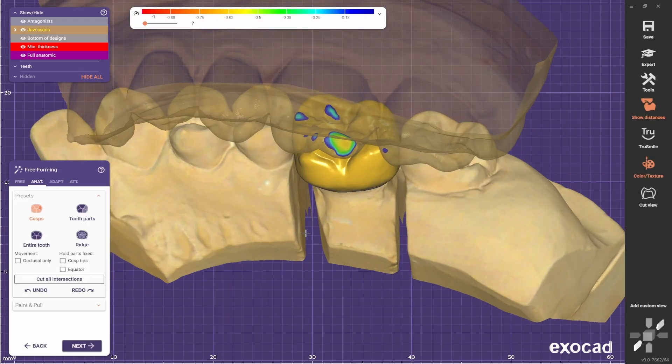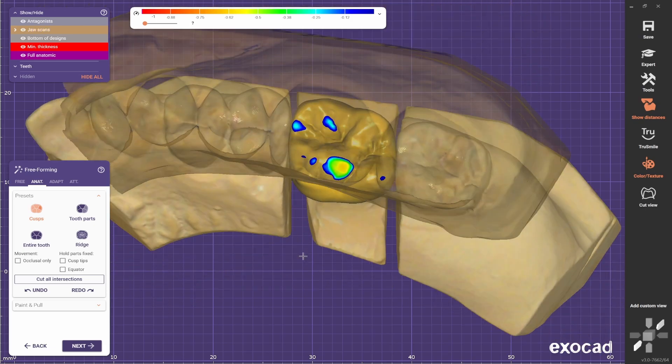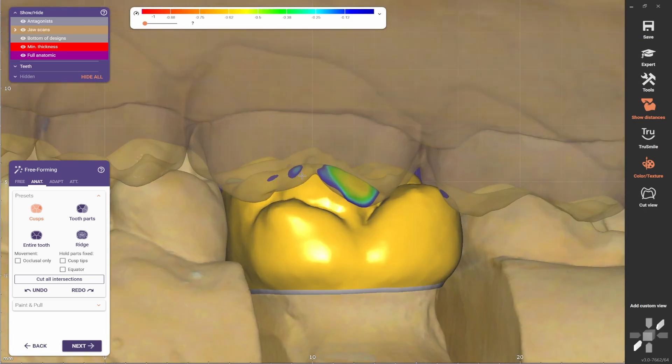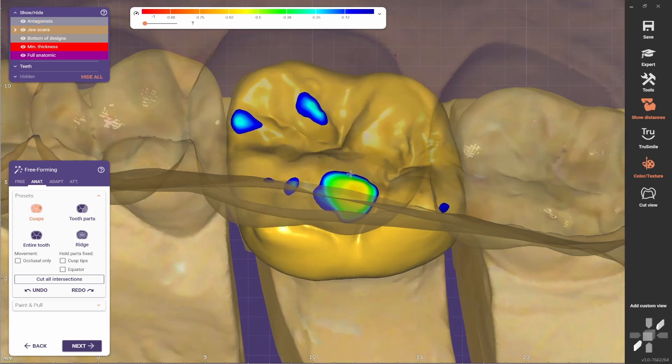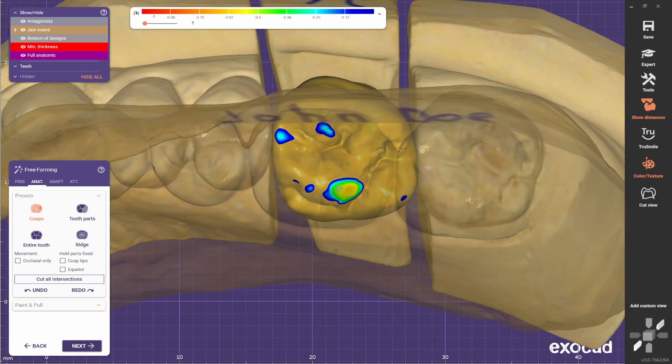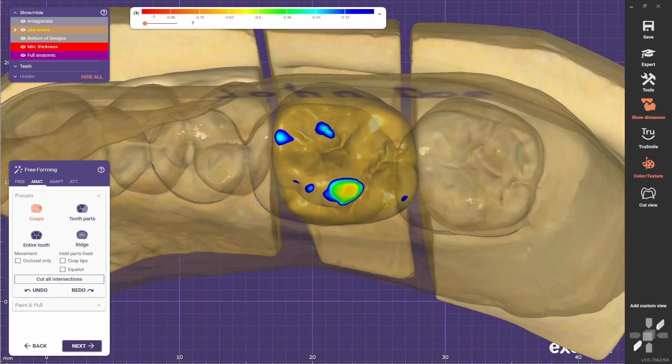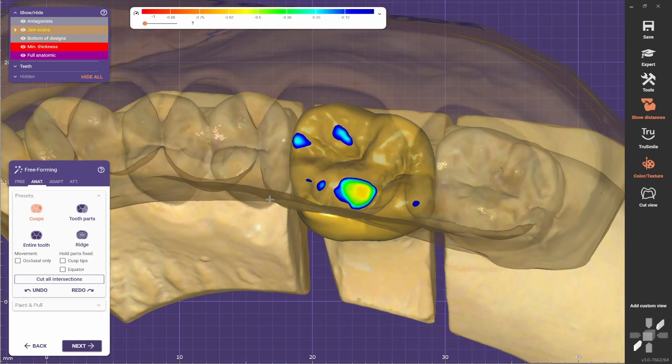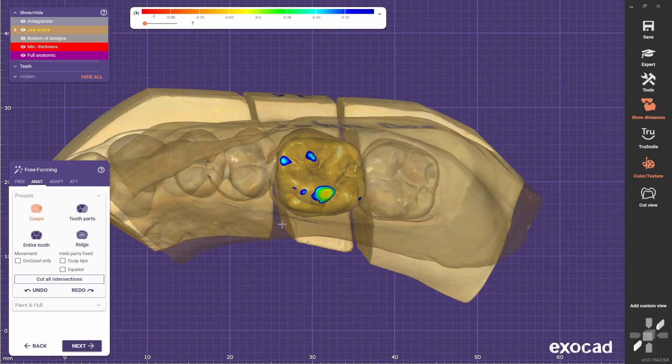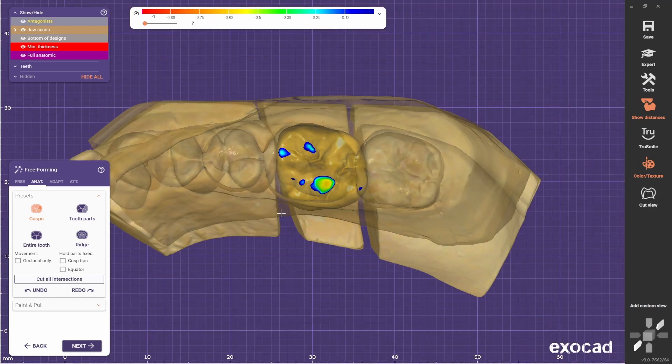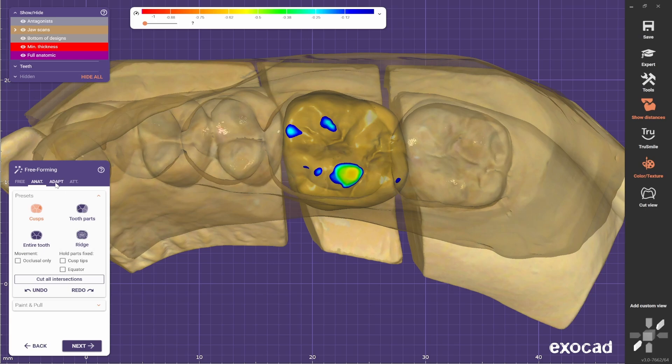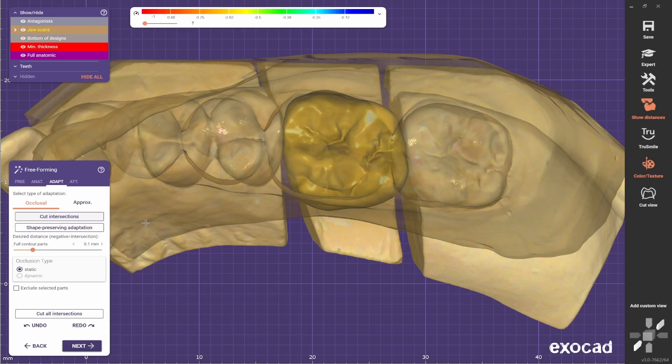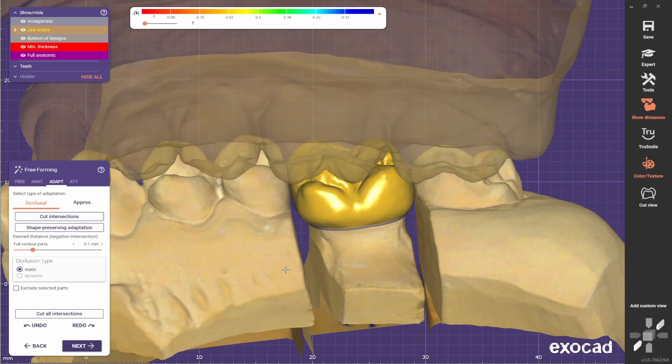Now you see that you have some of these marks which represent the strength of the contact points on the occlusion. To get rid of them, you go adapt and use the cut intersections tool, and the software will cut it for you.